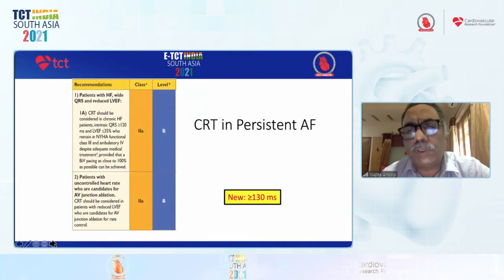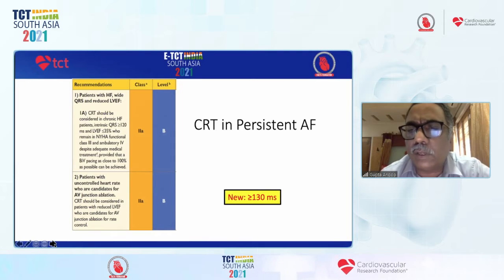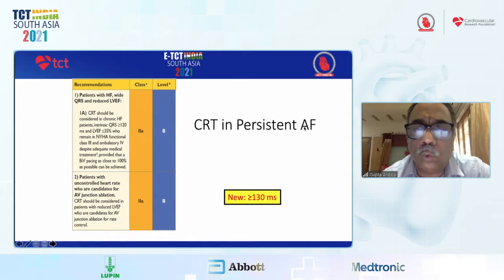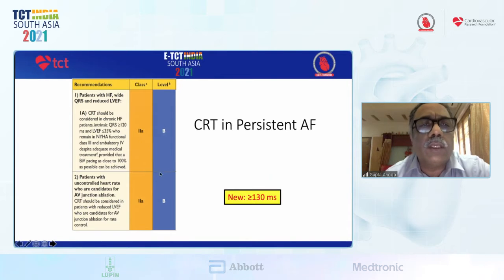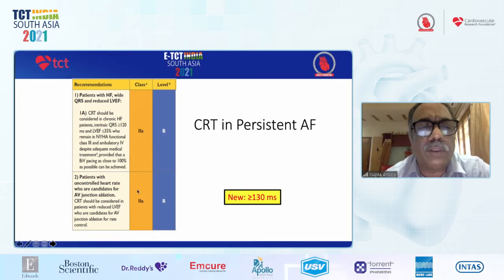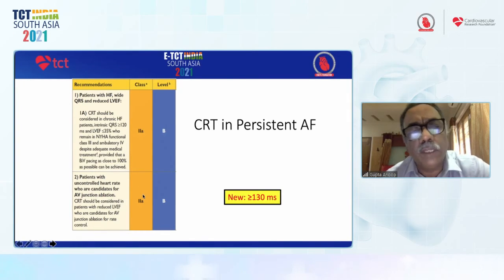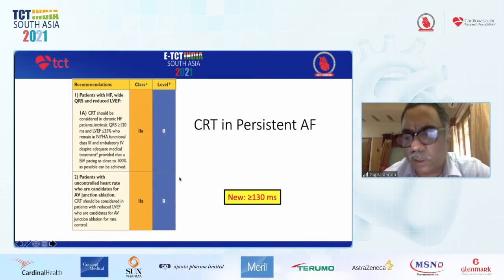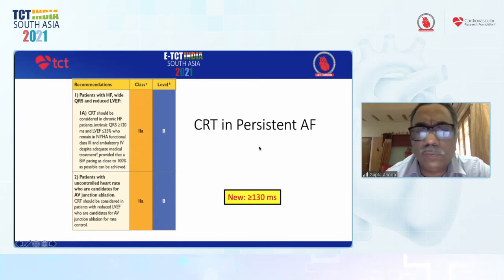This is a controversial subject. Again, in a patient with left bundle branch block and dilated cardiomyopathy, many times we see these patients have atrial fibrillation, and we know that these patients do not do well despite putting in a CRT and AV node junction ablation also. So right now, the class of indication is class 2A. And if you are doing an AV junction ablation, again it's a class 2A indication. So it is not a class 1 indication right now, but in selected patients, you can think about doing AV junction ablation, putting in a CRT, or probably doing physiological pacing.